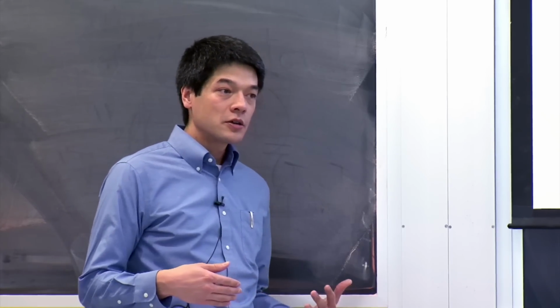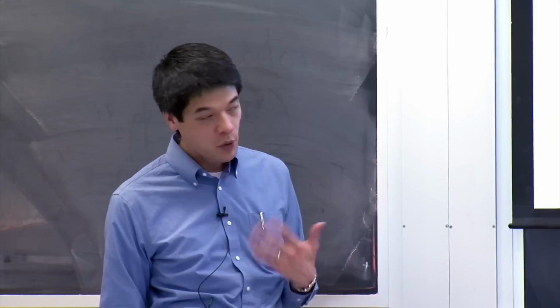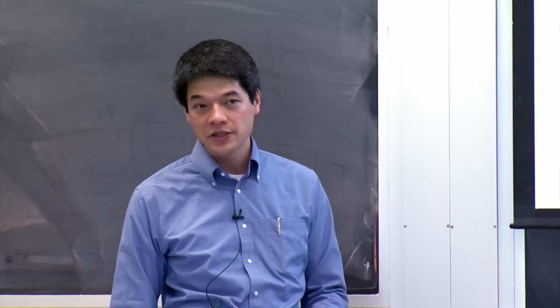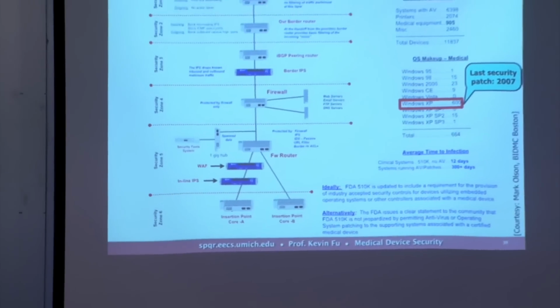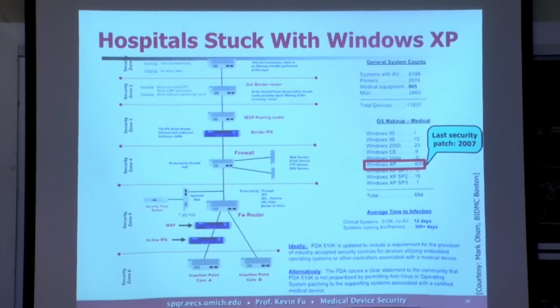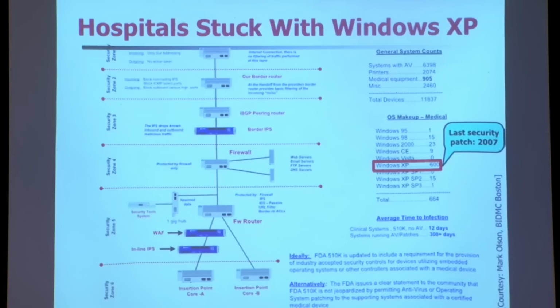Another stakeholder are the people who provide healthcare in the first place, hospitals primarily, or small clinics. If you want to find malware, go to a hospital. You're going to find some interesting malware. And here's why. So here's a screenshot from a colleague who used to work at Beth Israel Deaconess Medical Center here in Boston. And he kind of gave a map of his network architecture. There's nothing particularly earth-shattering about the architecture. What was interesting, though, was he listed the number of operating systems in his hospital on what were considered medical devices.